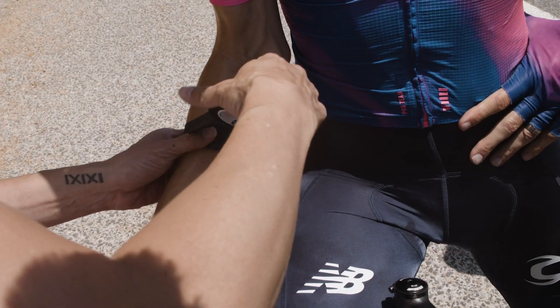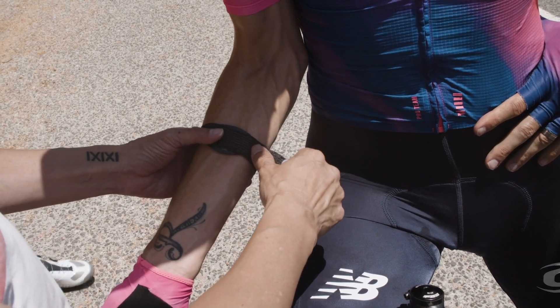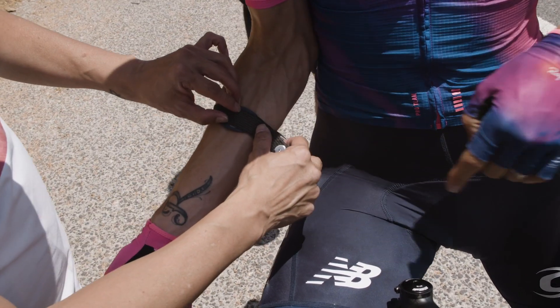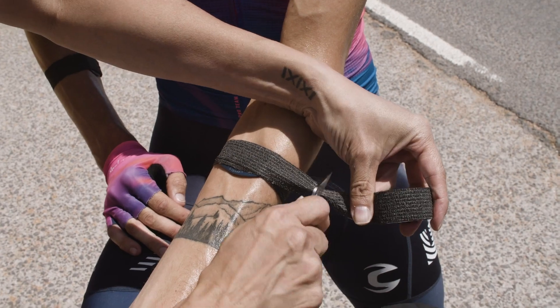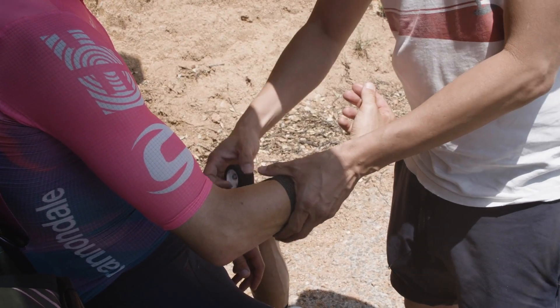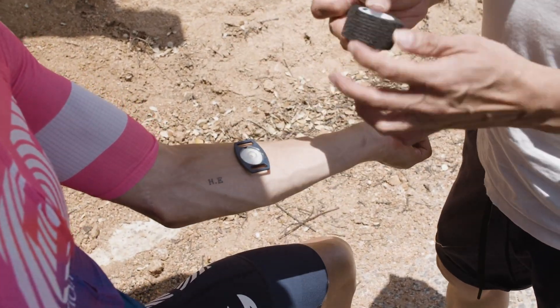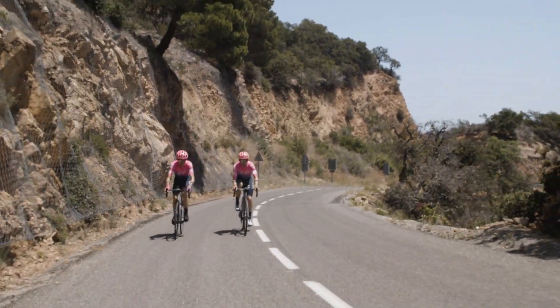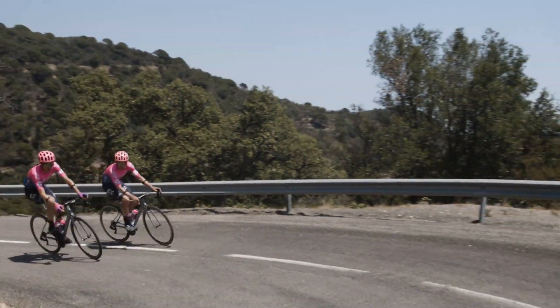The device just needs to feel snug but not too tight. Once it starts filling up, there's another port — if you overfill, it'll push the excess out, and whatever gets captured inside the tube will stick in the tube. It doesn't evaporate because the openings are too narrow. You're going to do a 10-minute maximal effort — an effort that makes you sweat pretty good — 10 minutes, no longer.